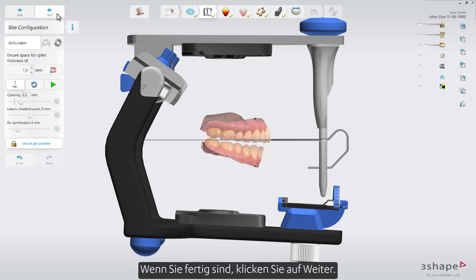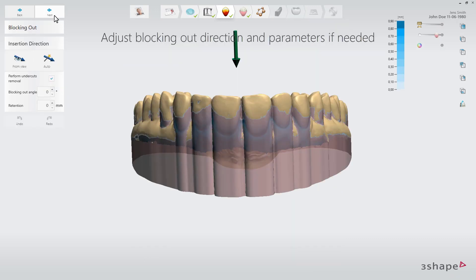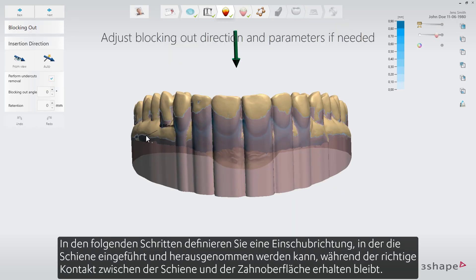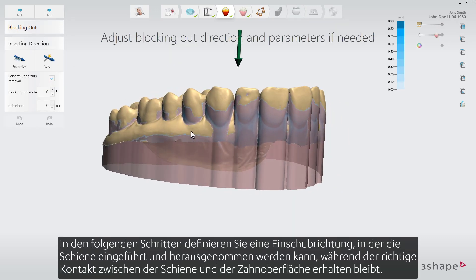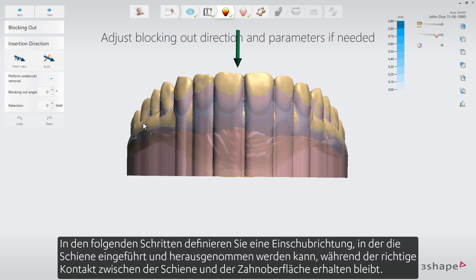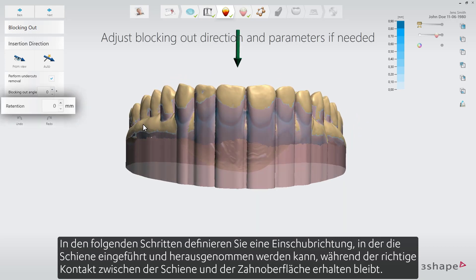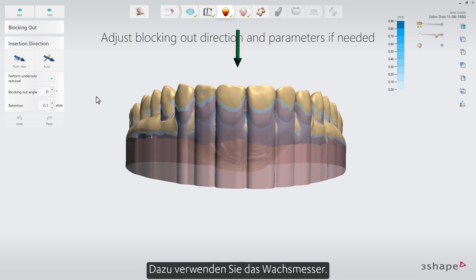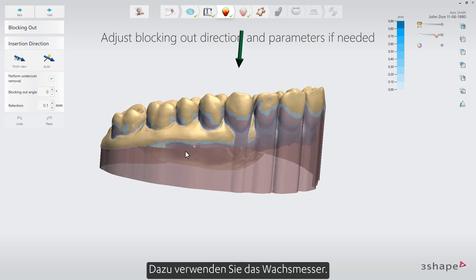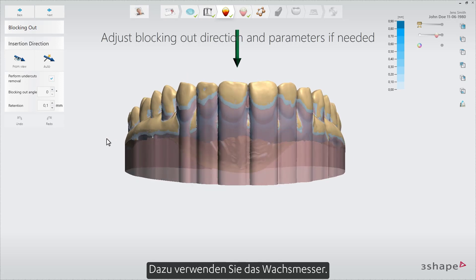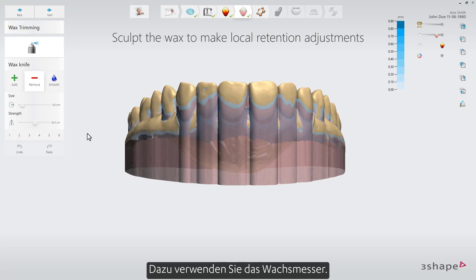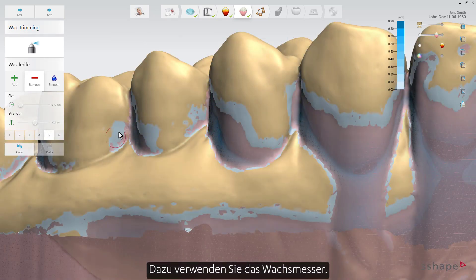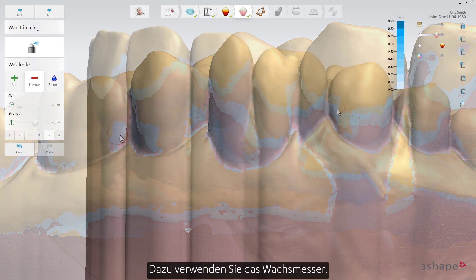When ready, press next. In the following steps you define an insertion direction that will allow the splint to be inserted and taken out while retaining the proper contact between the splint and the tooth surface. You can add both parametric retention and manual sculpted retention where you want the splint to have extra grip in a given area. For this you will use the wax trimming tool.